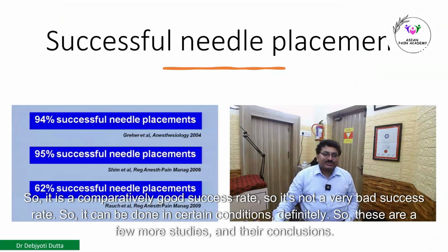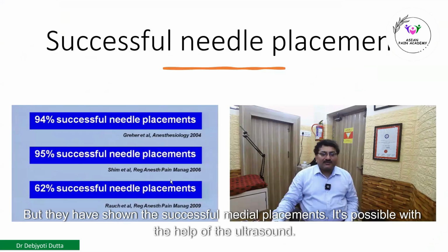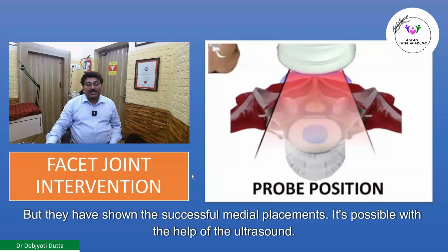So these are a few more studies and their conclusions. The lowest we got was around 62% in this study, and in the other studies, as they were definitely older studies, but they have shown the successful needle placement is possible with the help of the ultrasound.